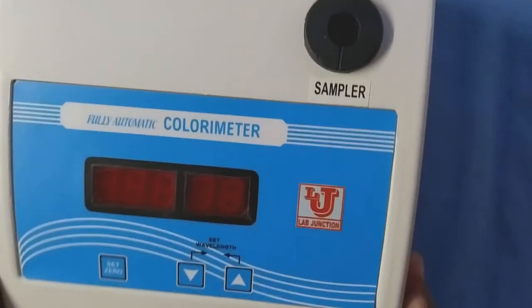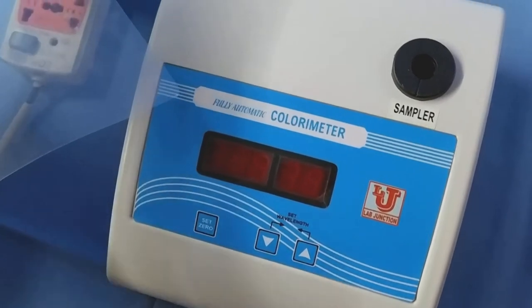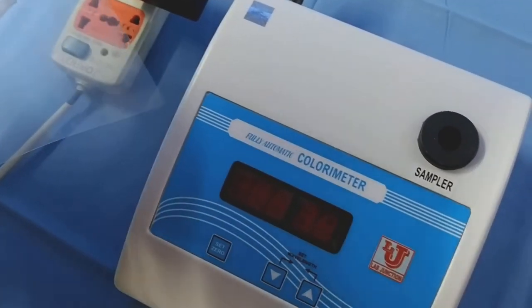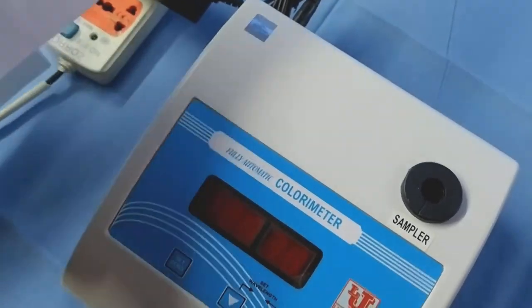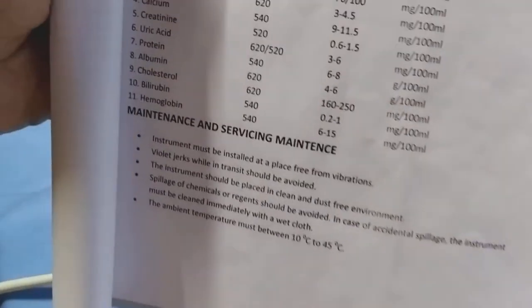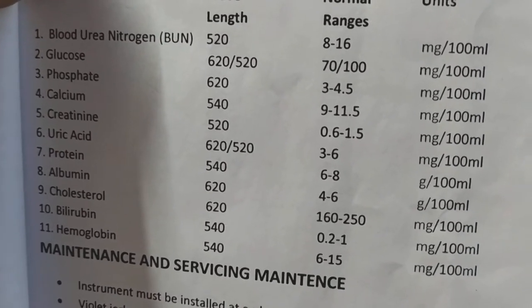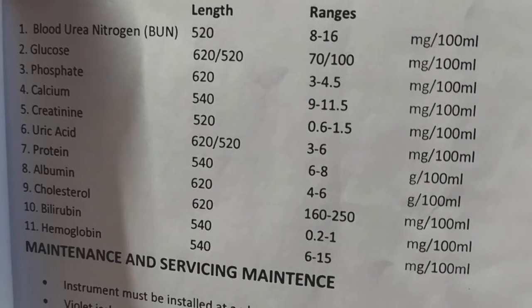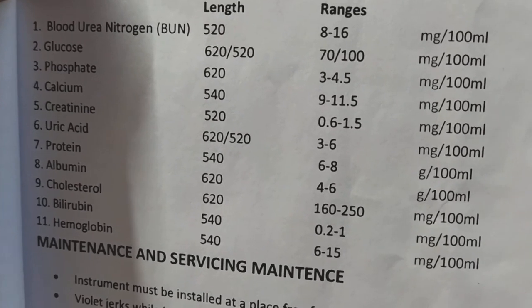With this colorimeter, we can do 11 tests of blood chemistry: blood urea nitrogen, glucose, phosphate, calcium, creatinine, uric acid, protein, albumin, cholesterol, bilirubin, haemoglobin.